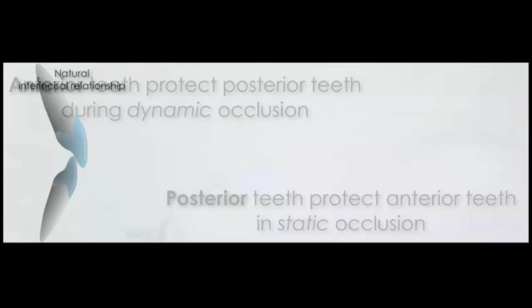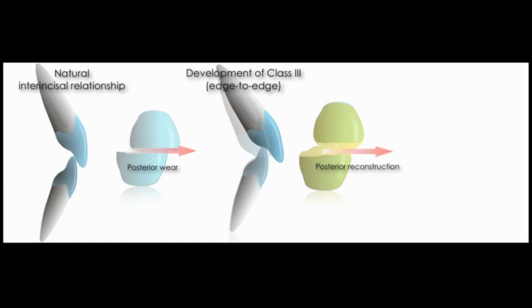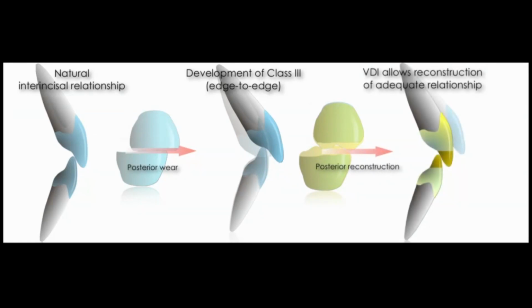And how can we do that? So if we have patients like this with a severe wear, we expect that we lose vertical dimension of occlusion by the posteriors. And so what happens? Mostly a development of class 3 edge-to-edge position. And if you have periodontally compromised teeth, sometimes there are changes to a fan-shaped anterior dentition, like it's shown over here. So what you can do now in the first step is reconstruction of the posteriors, and then you have the space to reconstruct the anteriors again or to perform ortho.